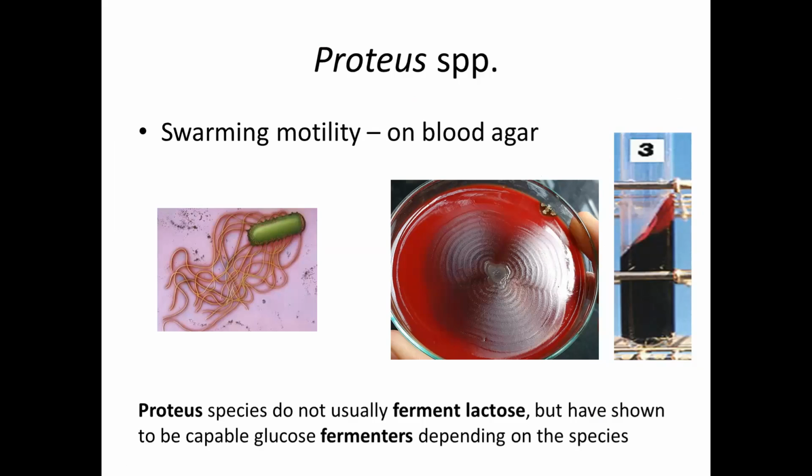So this practical involves a group of bacteria called Enterobacteriaceae. There are peculiar features, like I said earlier. They are oxidase negative, convert nitrates into nitrites, and are glucose fermenters. That is Enterobacteriaceae. The other group, if it is oxidase positive, is gram-negative bacilli, more towards Pseudomonas or Burkholderia species.